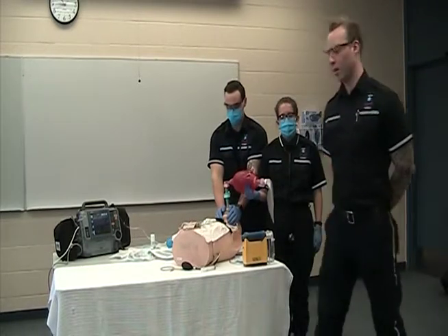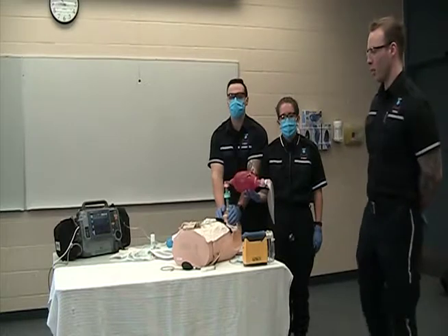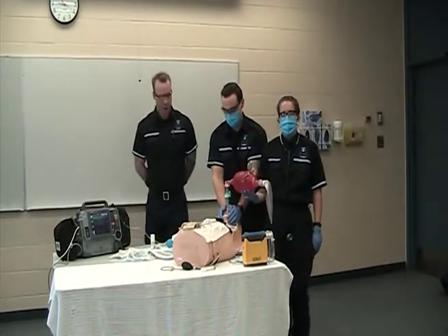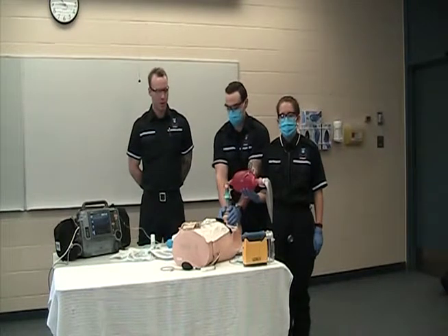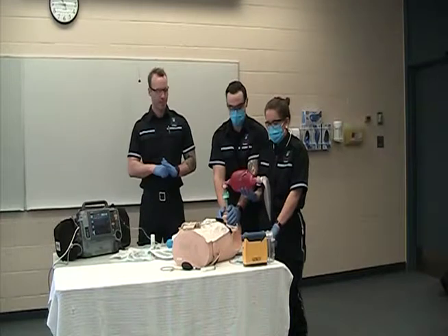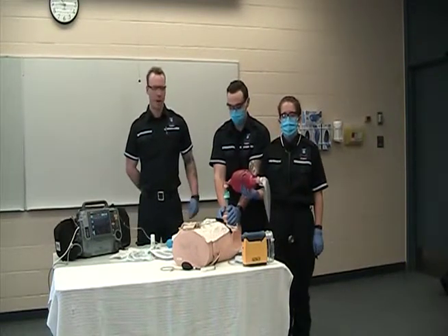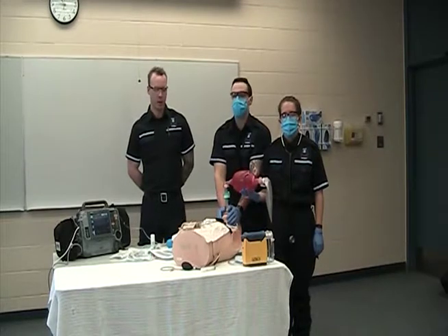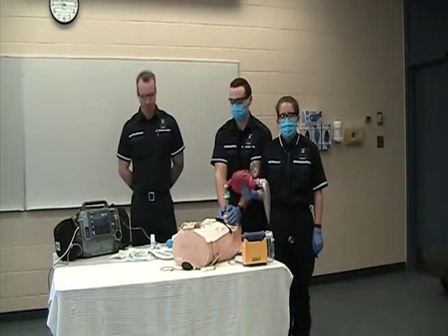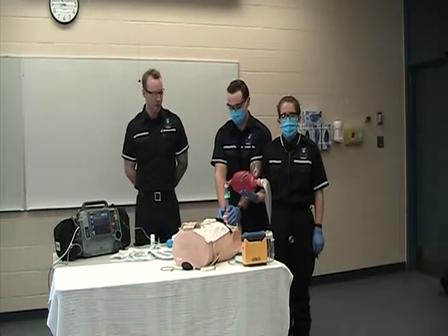After we've done the LEMON score and pre-oxygenation, we want to prep our equipment. So, starting with suction, we want to power the suction up to 300 millimeters of mercury. And we want to make sure that's tucked underneath the pillow of the patient's head. Ideally, with an adult, we want to suction between 80 and 120 millimeters of mercury. We want to make sure we have our HEPA filter, which is also on the BVM.